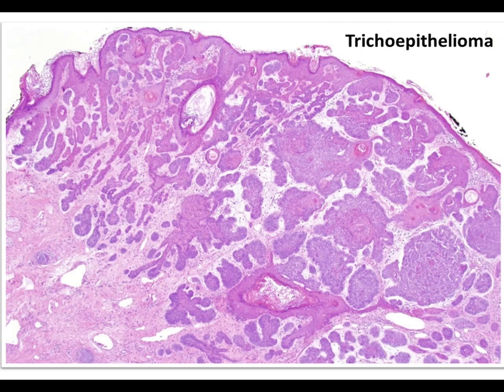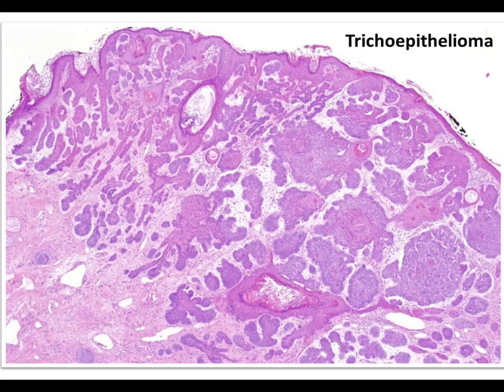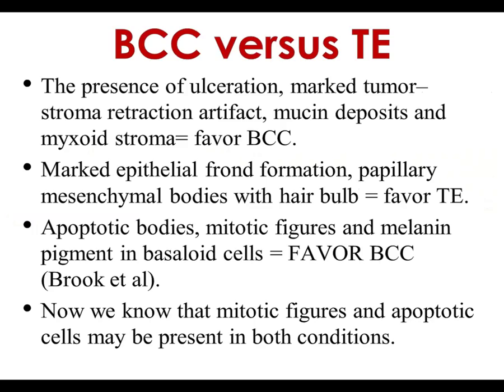Here we have a classic example of a trichoepithelioma. If you have a biopsy like this it would be very easy to make a clear-cut diagnosis. However, we don't always get biopsies like that — sometimes you get a shave biopsy and it's quite difficult to give an unequivocal diagnosis. In the literature there are many papers delineating histologic features: if you see ulceration, retraction artifact, mucin, or myxoid stroma that favors basal cell carcinoma, whereas papillary mesenchymal body differentiation favors trichoepithelioma.